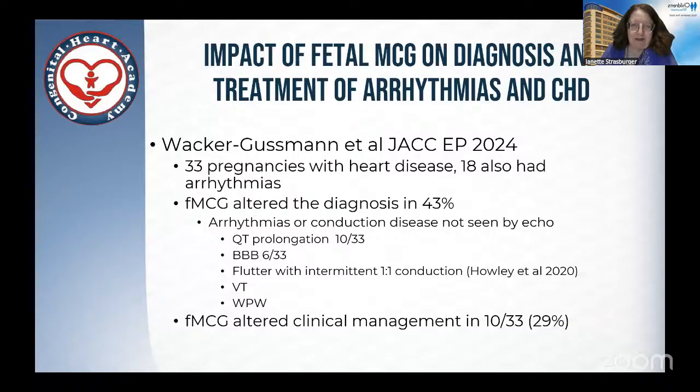I apologize, I got out of order here. So what is the impact of the FMCG on diagnosis? We looked at 33 patients with congenital heart disease a couple of years ago, and we found altered diagnosis in 43%. Some of the things that we found in congenital heart disease, although interestingly not in Ebstein's, we did not see QT prolongation in Ebstein's, but we did see it in other types of congenital heart disease like hypoplastic left heart syndrome and heterotaxy.